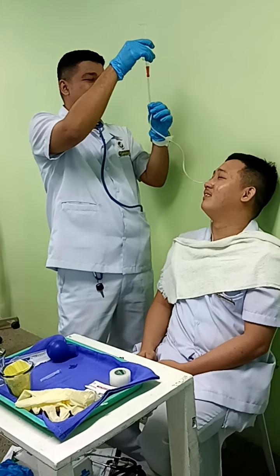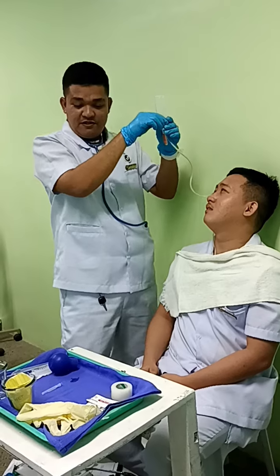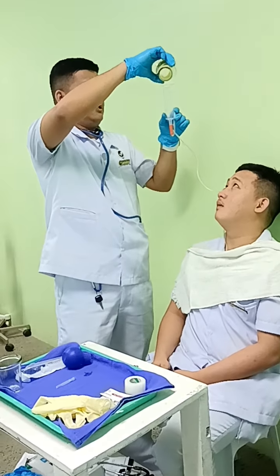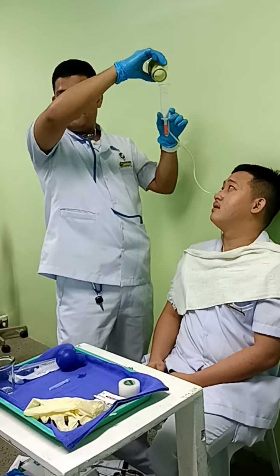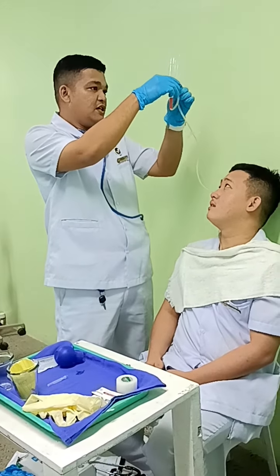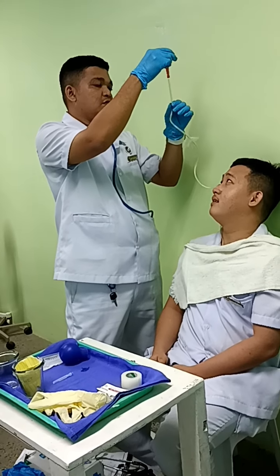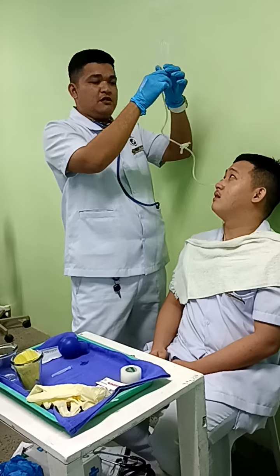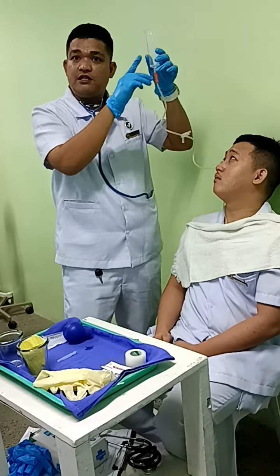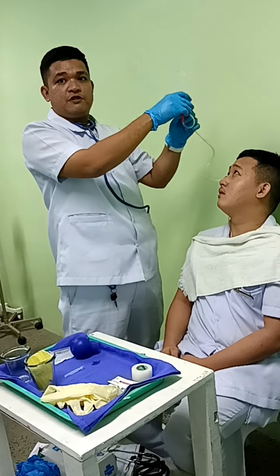Next is to start the food feeding. Sir, I will be giving your food. So gently. Since there are residues left, we have to irrigate it again, once again with water for future purposes.